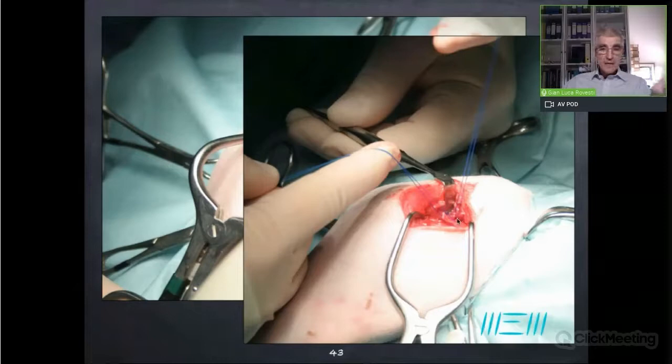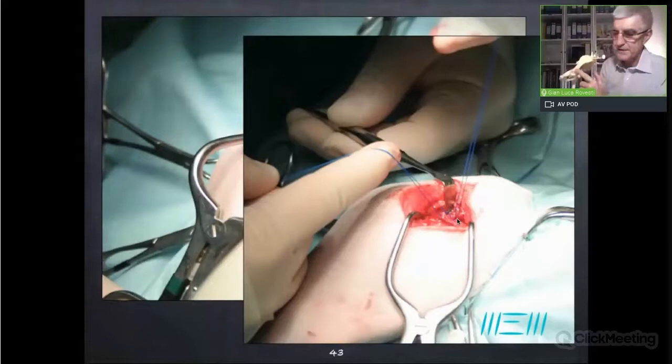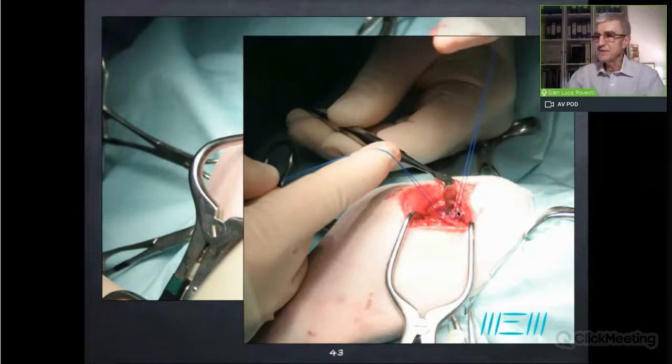If you palpate this area of the acetabulum, you can palpate a rough area that is cranial on the acetabulum, okay? This rough area is where the tendon of the rectus femoris inserts. And you can palpate it as a big rope, okay? As a matter of fact, if you are not sure, when you insert this stitch on the tendon, you can actually elevate the dog with the suture. If the suture cuts through soft tissue, you were not through the tendon of the rectus femoris muscle. This is a very strong tendon.